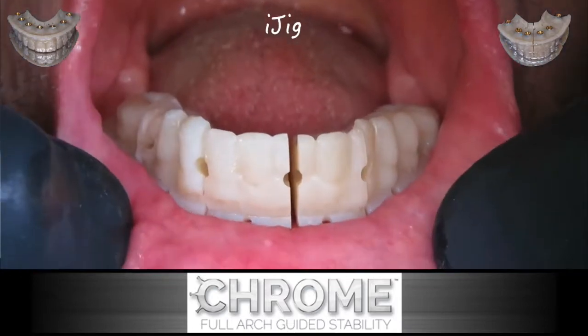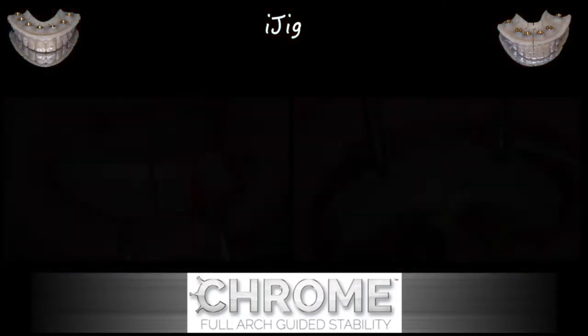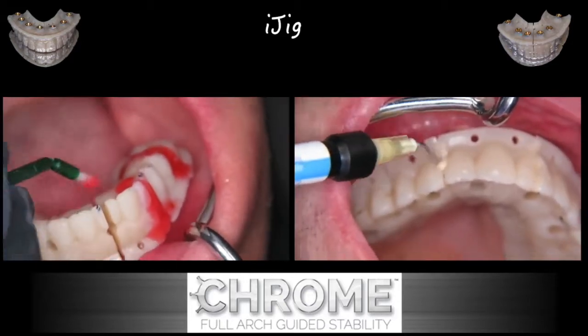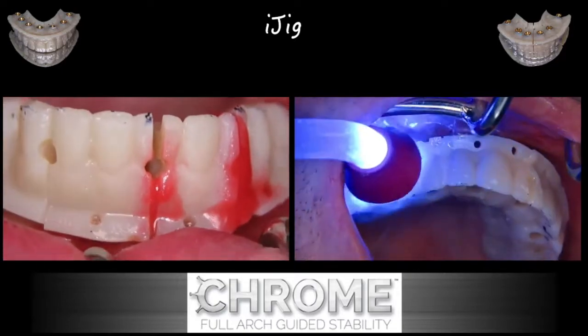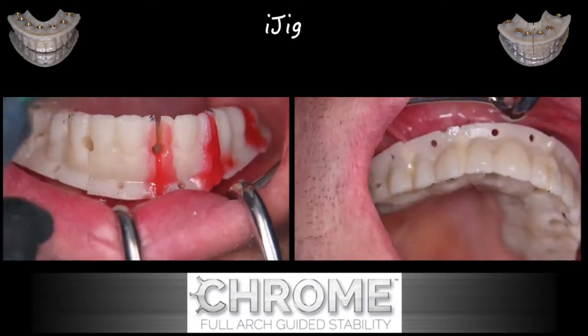Using the vacuform matrix, we're able to seat this. You can see the spacing that exists, and there are also holes made to introduce either an acrylic material, a resin pattern, a flowable composite, or acrylic as well. On the left you can see the resin; on the right, you can see the flowable composite that's light cured.